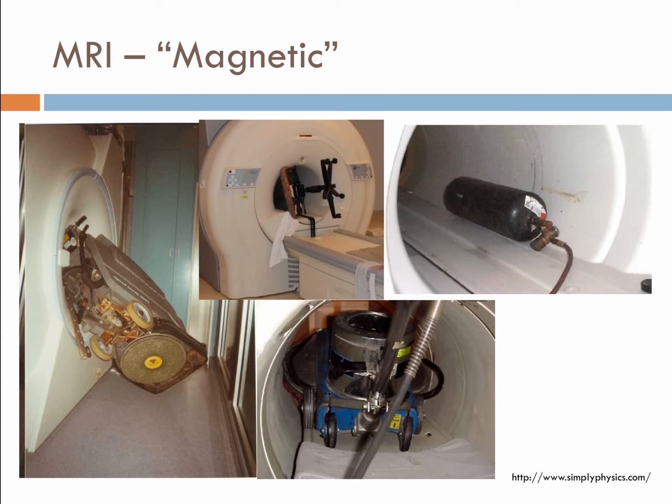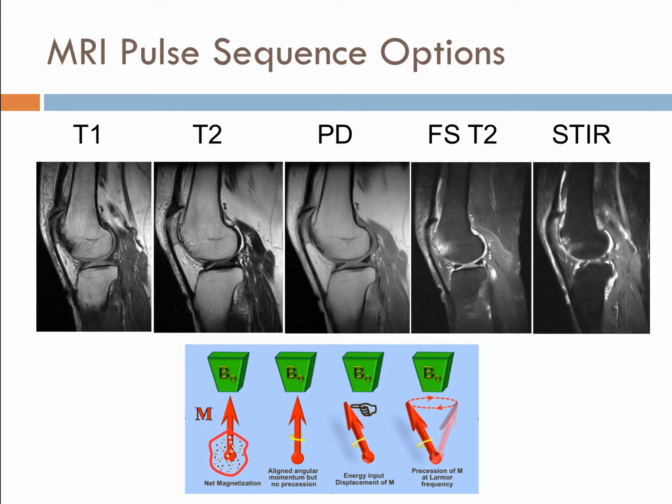The way an MR works, I'll show the next slide. If you look at the bottom of the slide, all of your hydrogen atoms within your body are just spinning around doing their usual thing. When we put you into an MRI, your hydrogen atoms align with the magnetic field. We put in an RF pulse and flip them around, and as they relax back, they give off a signal, and that's what we use to create an MR image.